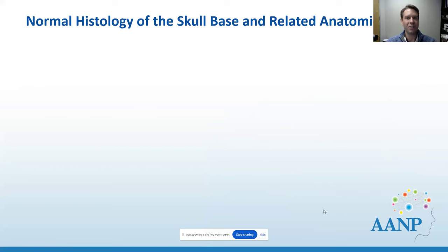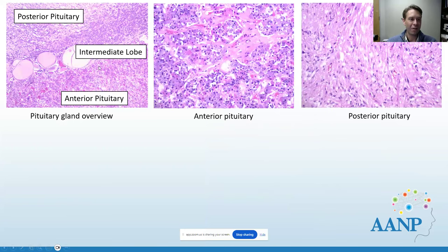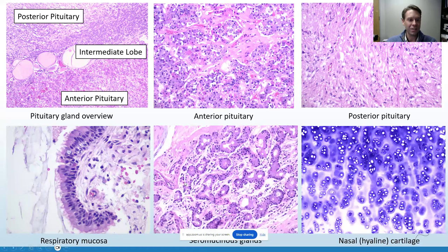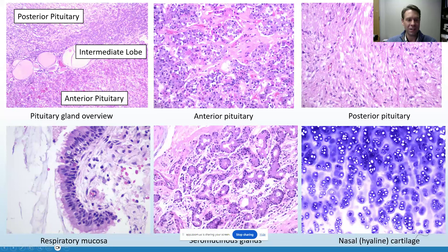Some normal histology of the skull base: we're all pretty familiar with the pituitary gland, with the anterior pituitary's acidophils, chromophobes, and basophils in their acini, and the posterior pituitary that looks more spindled, with axonal swelling known as Herring bodies. Within the skull base, a lot of what we deal with comes from the sinuses, so we have respiratory mucosa with pseudostratified ciliated columnar epithelium, goblet cells, seromucinous glands, and we can even have salivary gland neoplasms in this area, as well as hyaline cartilage and bone.